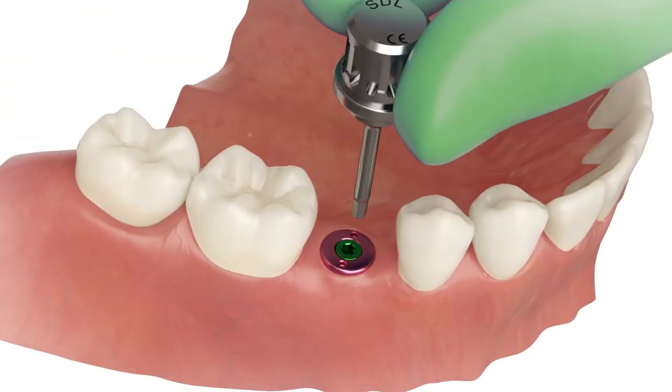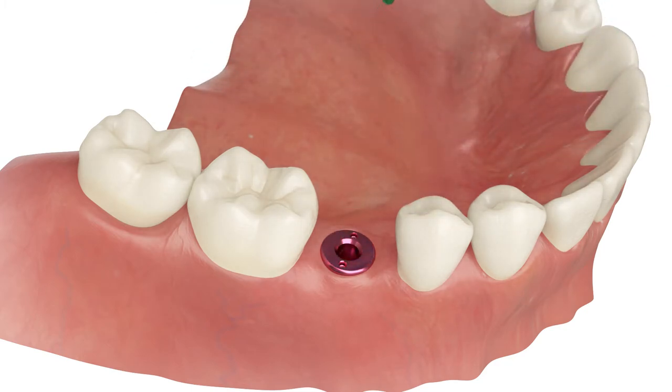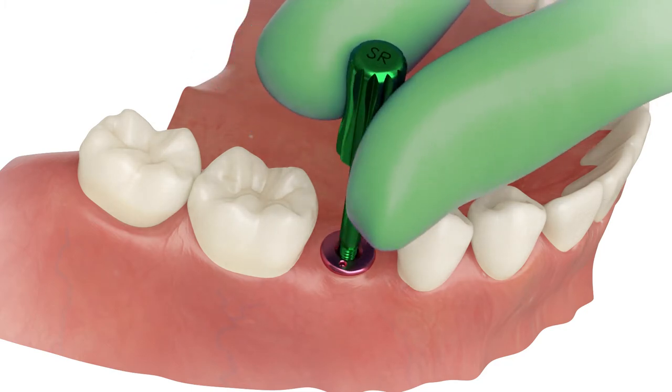Remove the healing abutment from the implant. Use the abutment extractor for easier removing.